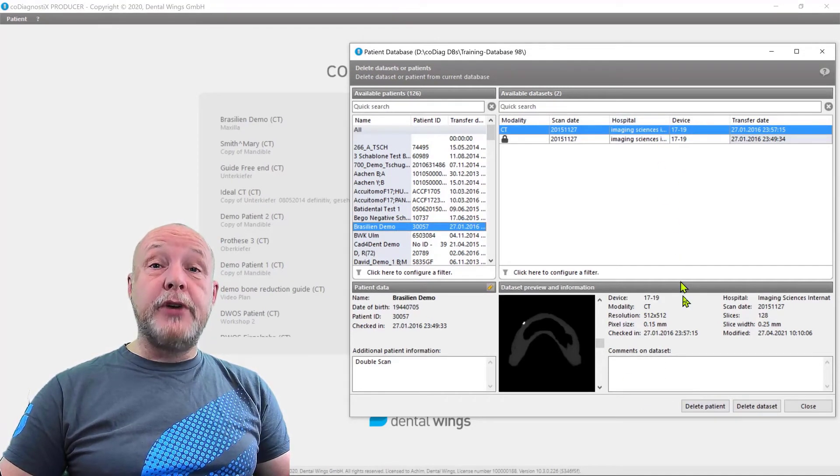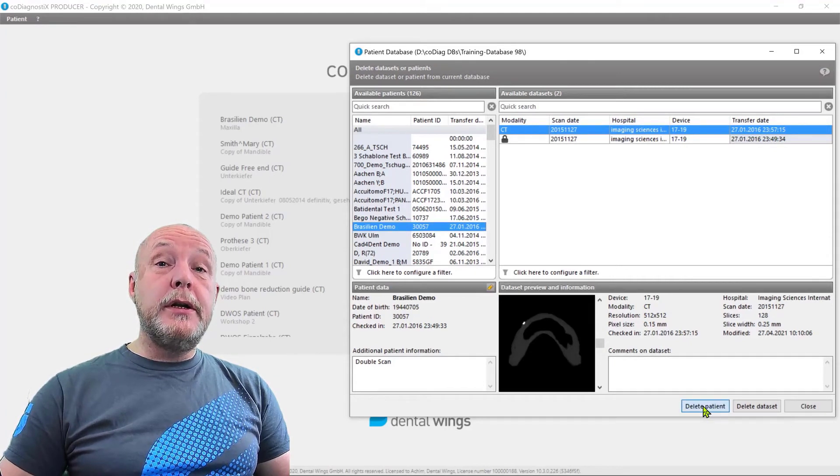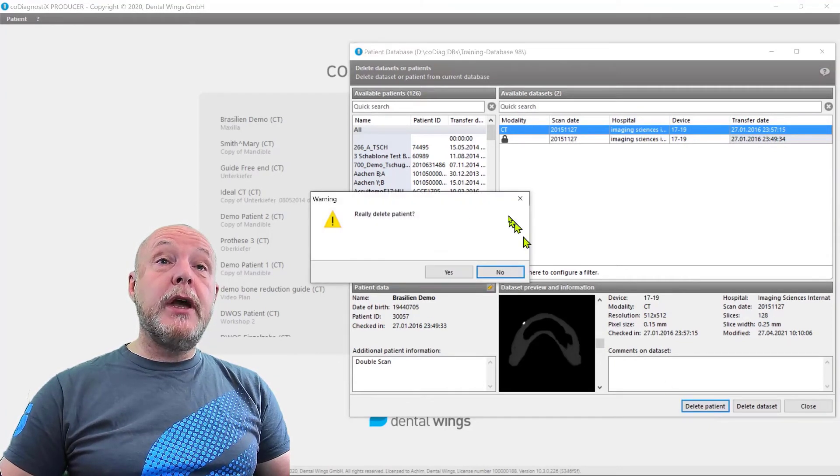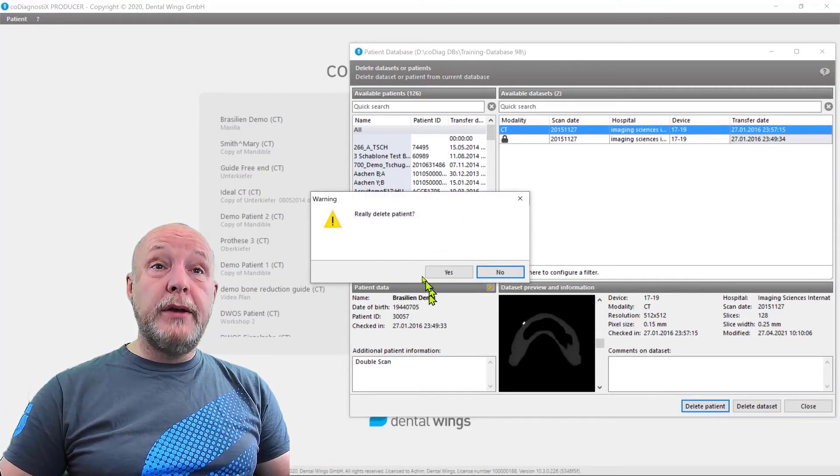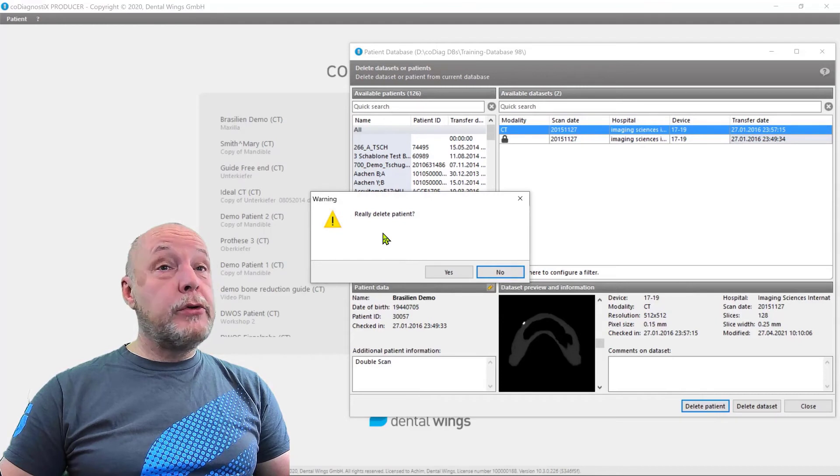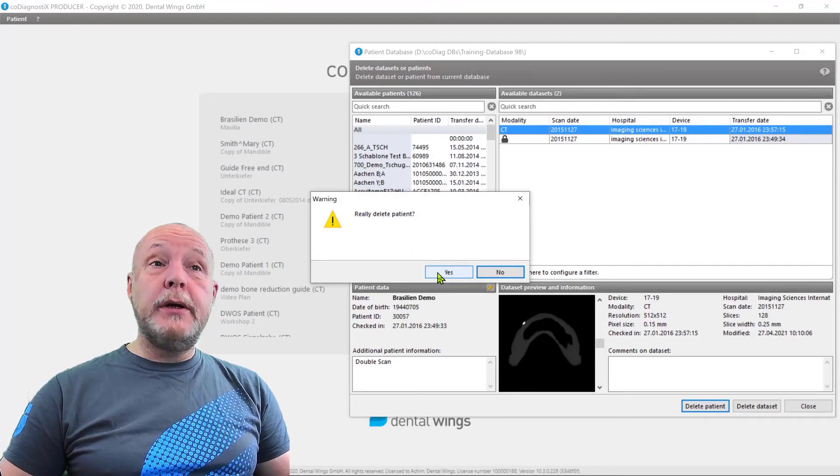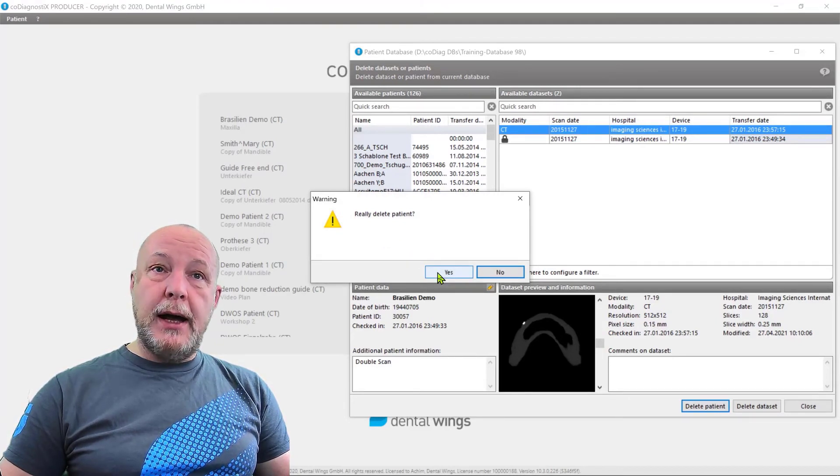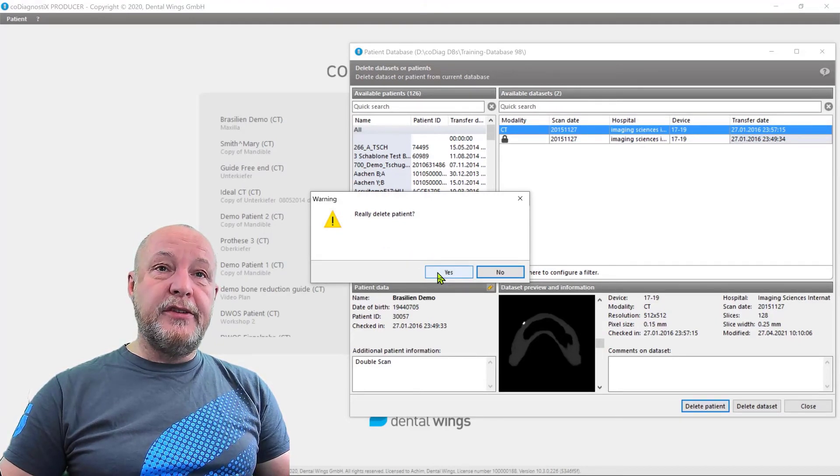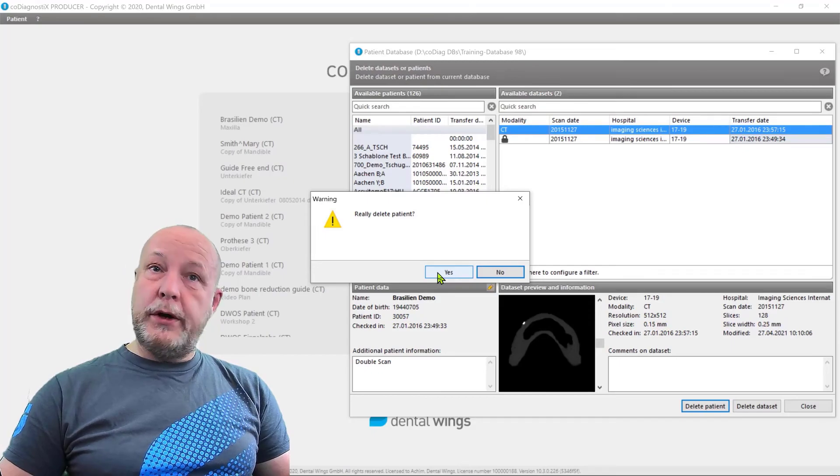It's different. So if you go here, delete a patient, you get one request. Do you want to do it really? But if you confirm here, you cannot undo this procedure. Be aware what you are doing.